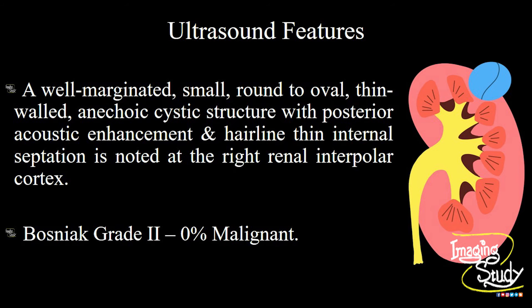In summary, a well-marginated, small, round-to-oval, thin-walled, anechoic cystic structure with posterior acoustic enhancement and hairline thin internal septation is noted at the interpolar right renal cortical region. These features go in favor of Bosniak Grade II, which suggests no chance of malignancy in this case.